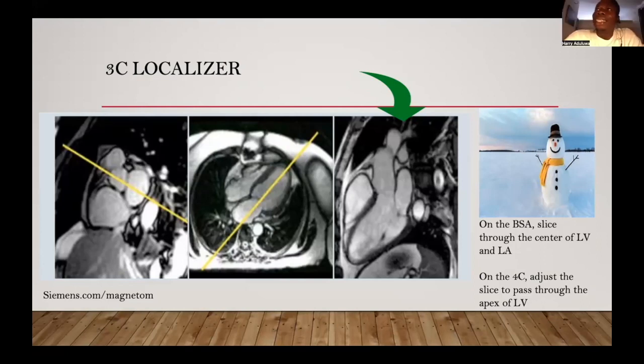Yeah. There's something, and that's the white blood takes a longer time. It has a longer relaxation time than the dark blood. If you scan immediately the white blood, you are not wrong. You are very correct. But the idea is, patients are oxygen sensitive in the MRI system, and you don't want to stress them too much at the beginning of the scan, because those are the point that you want to get the best imaging. You understand? When you keep them too long during the white blood, after you scan your dark blood, that takes some few seconds, you then begin to see them pant for air.